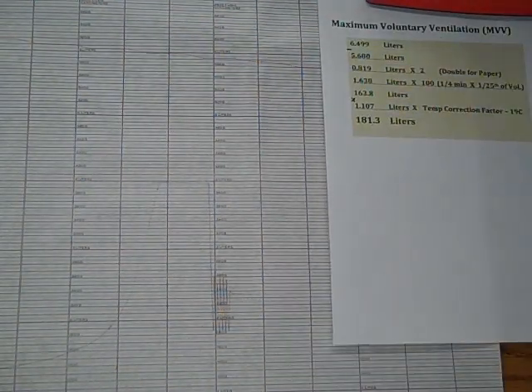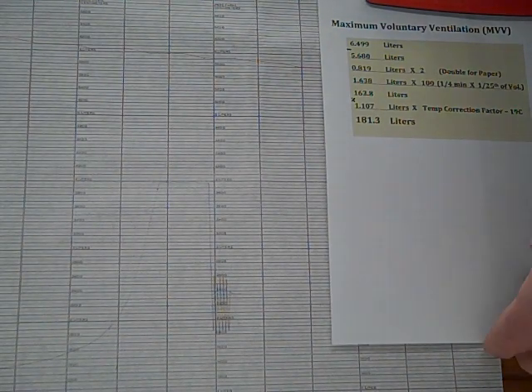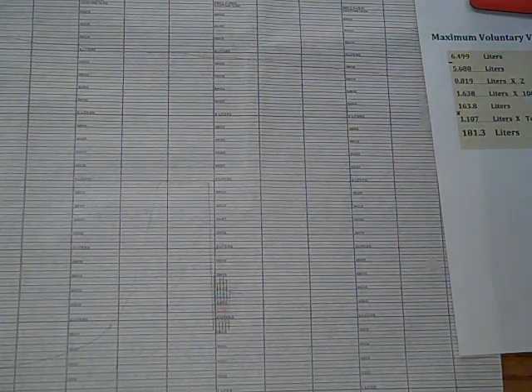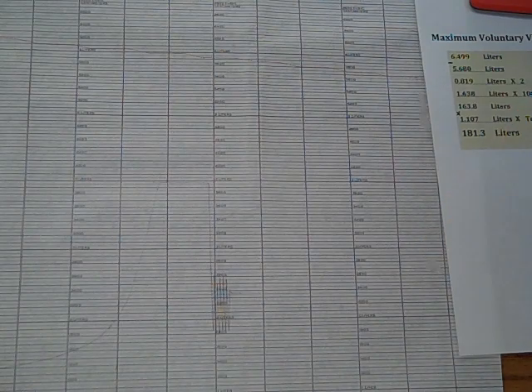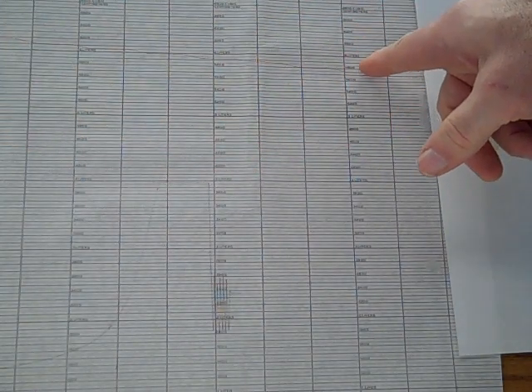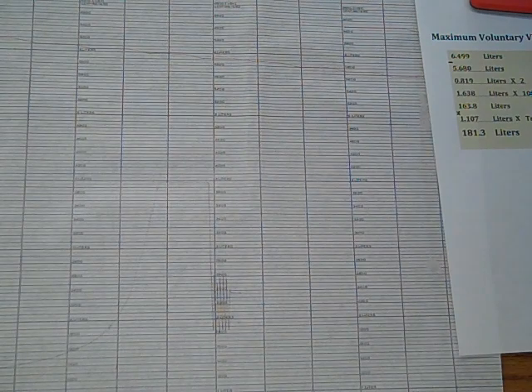Our last measurement we looked at was the maximum voluntary ventilation. Here we used another set of needles on the spirometer, and we're using the pen that measured the peak expiratory or maximum voluntary ventilation. As the drum spun one full rotation, this was measuring our breaths, and you could see it started here, and each breath it went a little higher until it came out right here. And we measured the difference between here and here, and that would be in 15 seconds.